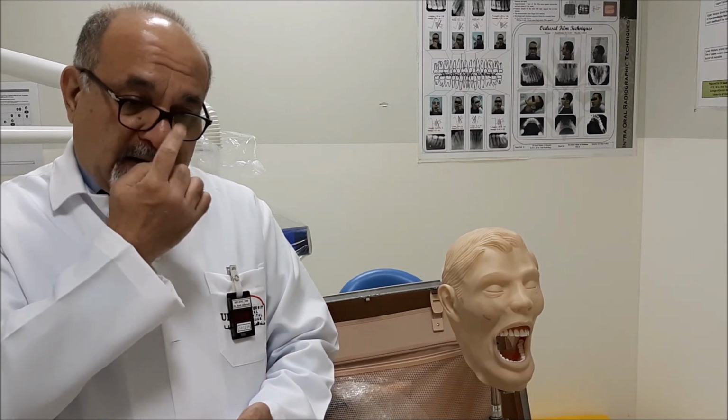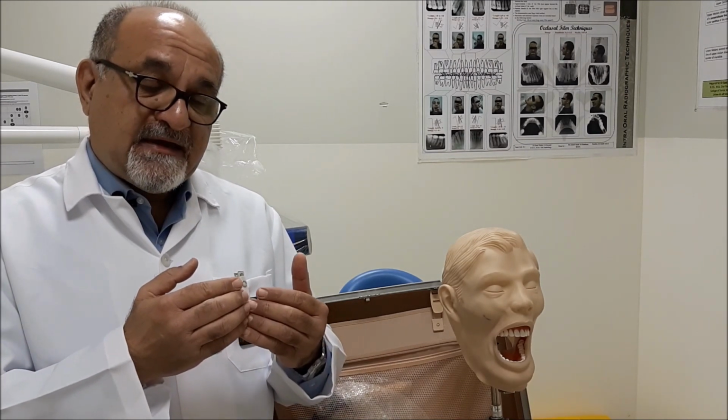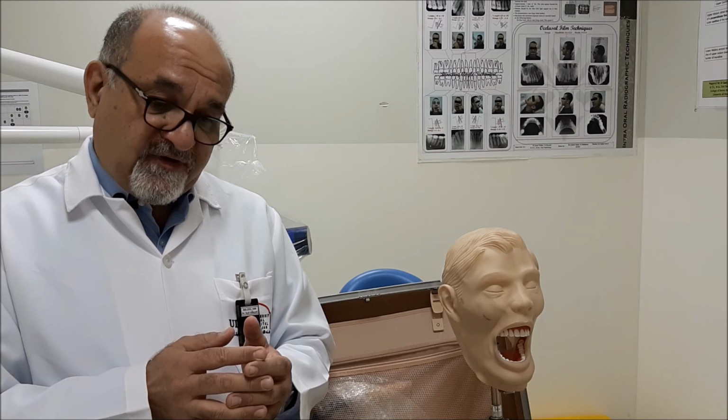Tube shift technique is a maneuver that we usually go to in cases of trying to locate the depth, which is the missing dimension in the two-dimensional radiograph.